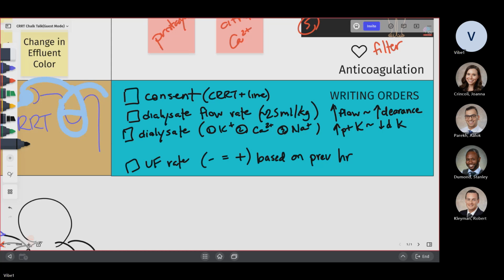Okay, with the CRRT I have to check it out. I'll be very honest, I'm not very sure with it, but it should be a possibility to give it post filter. The only problem is going to be the flow rates. If the flow rate is very slow, you have to maintain a slow transfusion rate for the blood, because remember, you cannot have a high pressure on the circuit. So that's something, but I'll definitely check it out tomorrow if it is a possibility.